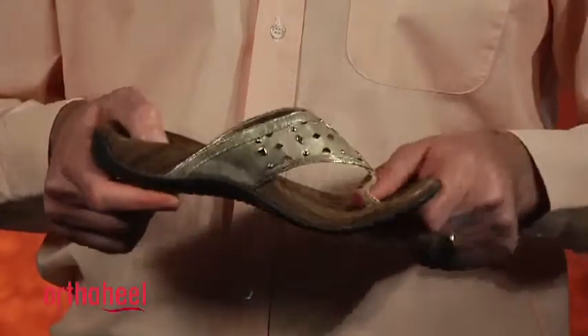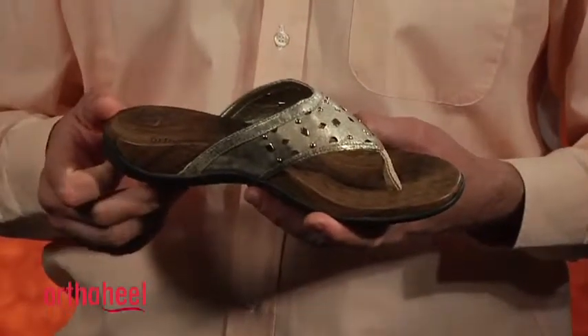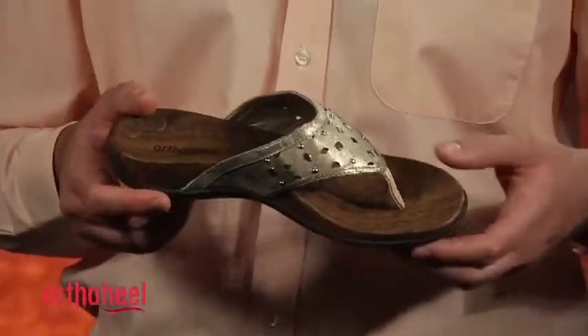They're very lightweight, they're flexible in the forefoot, and it's a soft padded upper with a fabric toe post to help with comfort. We've also got these great metal embellishments on the upper and a faux woodgrain print on the footbed to give this some real style.